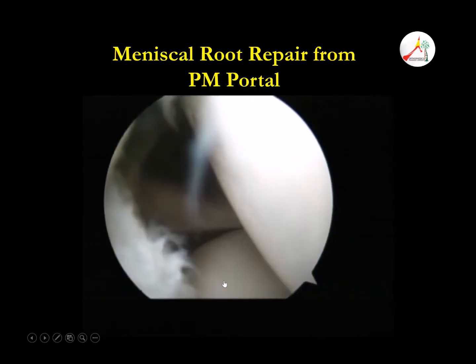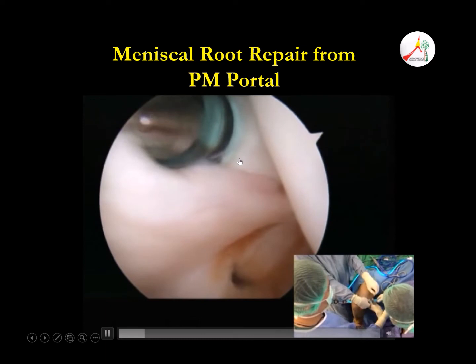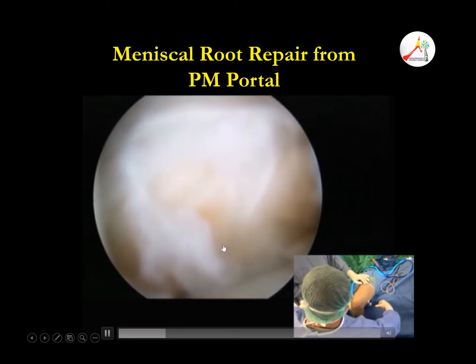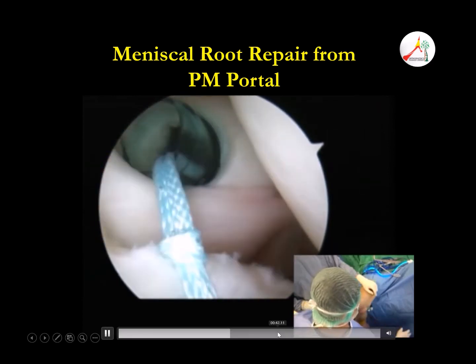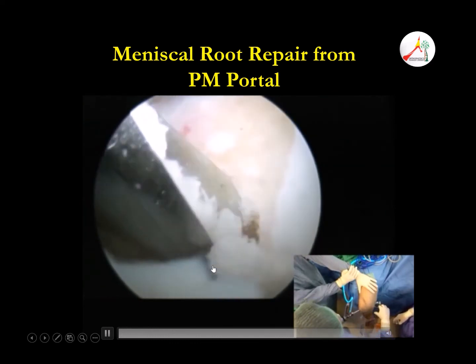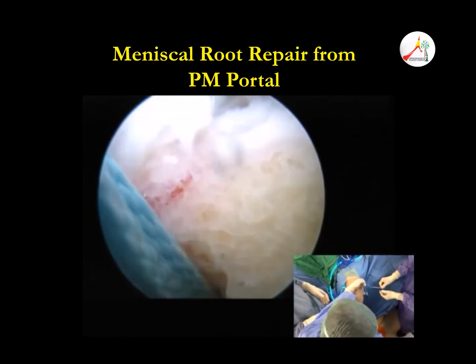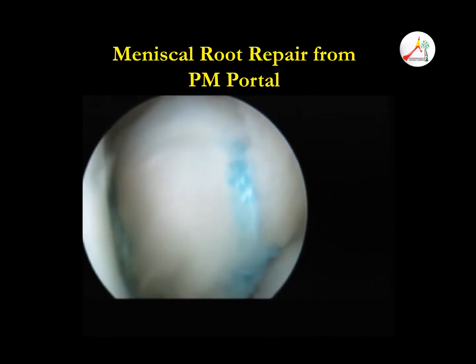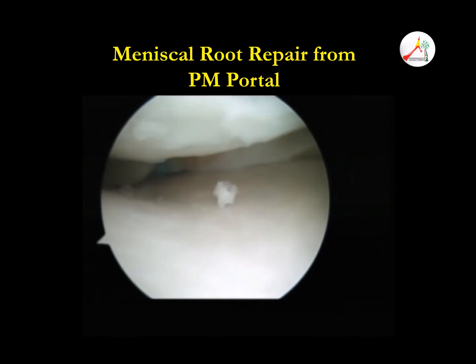So if the joint is very tight, and sometimes you don't need to release the MCL, you can come from the back, especially with meniscus extrusion to the back. So you can make 2 tunnels on the posteromedial side, pass the suture in, and then make a tunnel from the back, pass this suture in, and make a drill hole. Everything is done from the back, so you don't have to release the MCL. This is another way we do it nowadays, because sometimes it's very difficult to get through. Whenever you don't release, you can make a cartilage injury because you try to go to the back of the joint. So this is another way, the posteromedial approach.